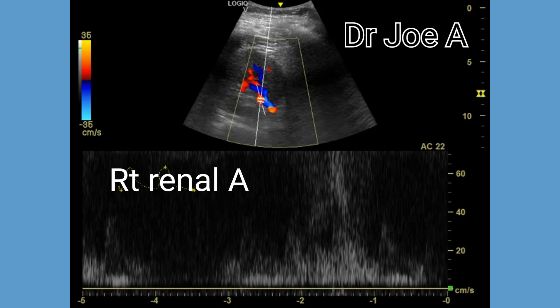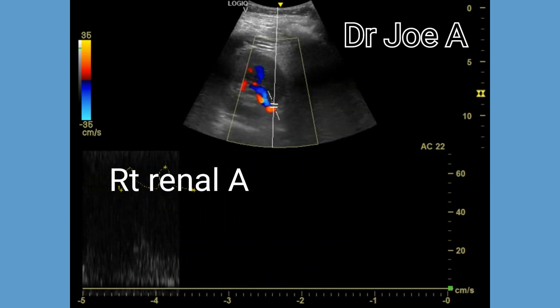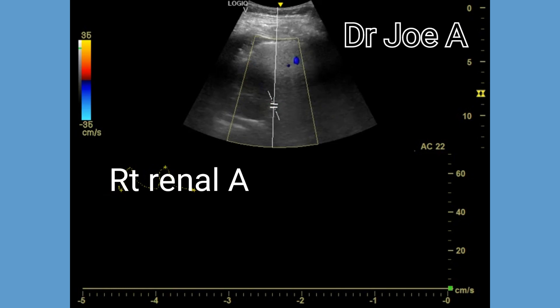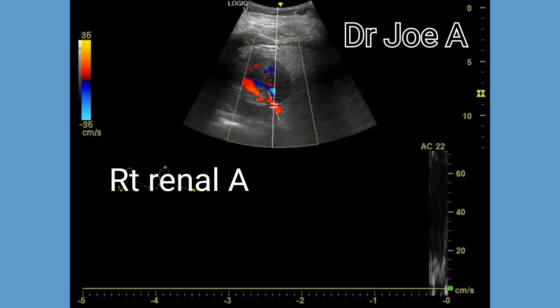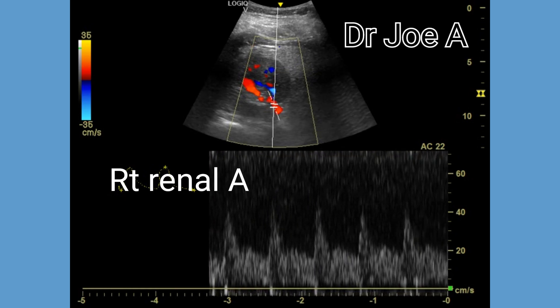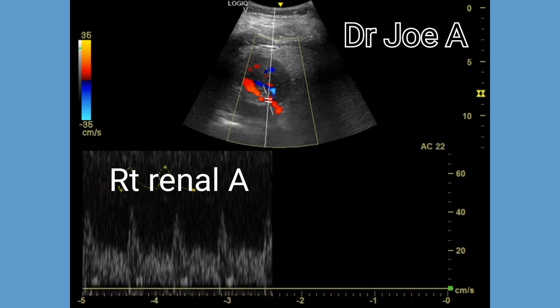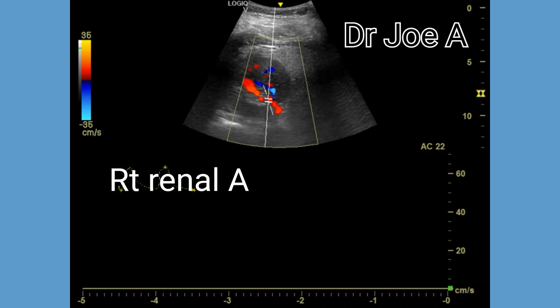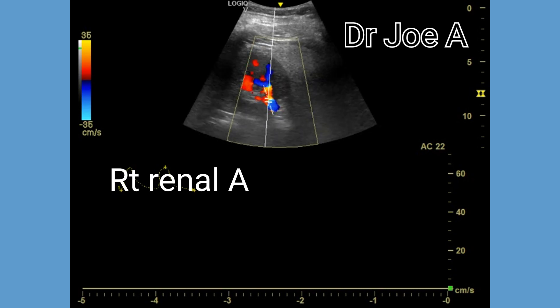The end diastolic velocity is less than 50 centimeters per second. The resistive index or RI is usually between 0.5 and 0.7. A high resistance waveform in the renal artery may indicate renal artery stenosis; however, in this case it is normal. The right renal artery shows a PSV or peak systolic velocity of 40 centimeters per second, which is normal. It is also good practice to measure the renal aortic ratio or RAR — in this patient it was normal.